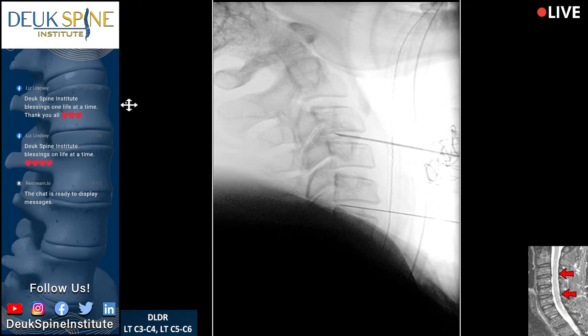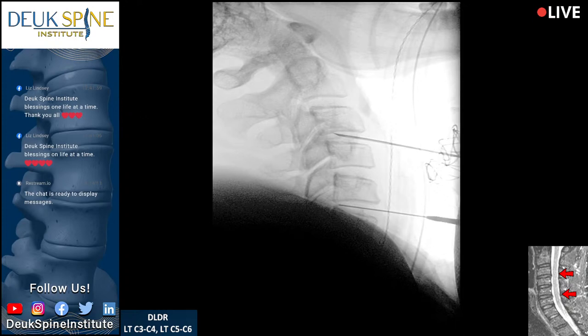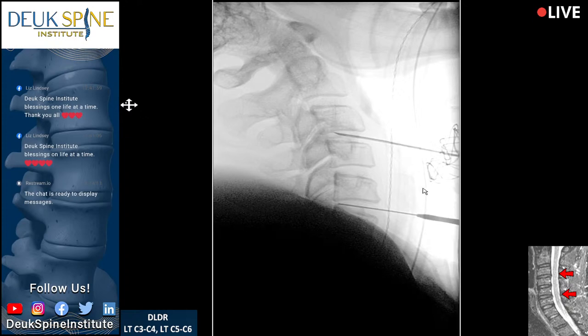If you're going to do this kind of surgery using guide wires, it's very important to stabilize the guide wire. We're passing down through the incision. If you look at the tip on that x-ray, we're passing the endotracheal tube right now — there's the esophageal temperature probe. So you know where the trachea and esophagus are. It looks like we're going through those structures, but we're not — we're going to the side of them.